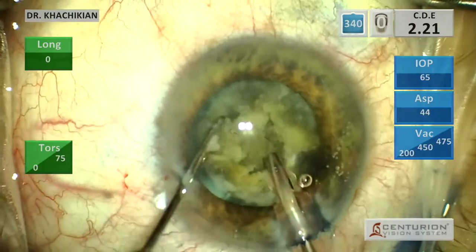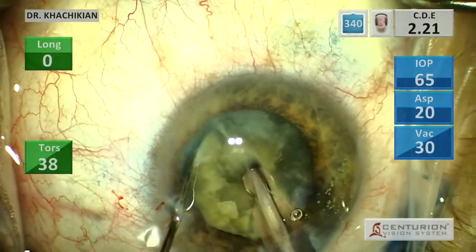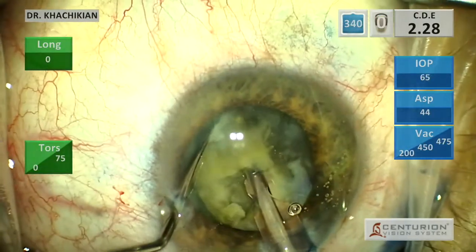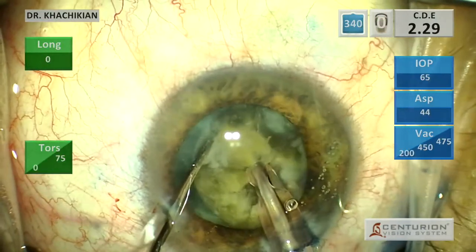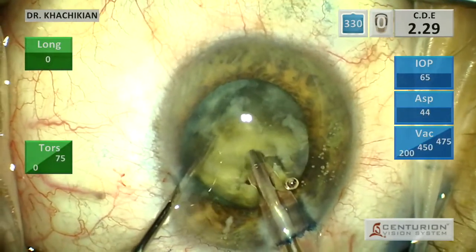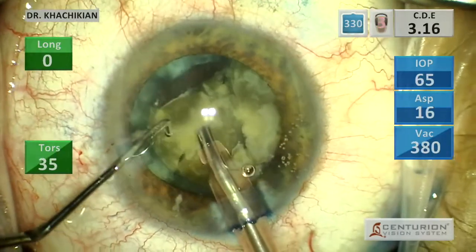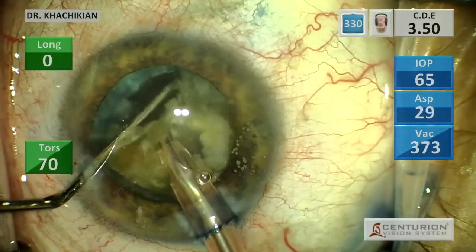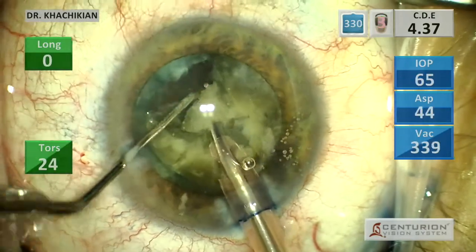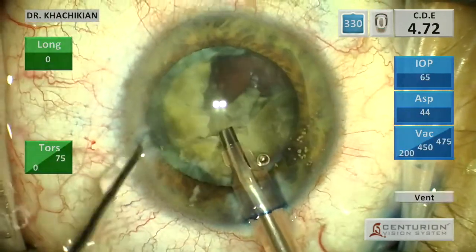There's another one with a lot of stretching — you can see that lateral stretching of the lens. Lateral movements are very well tolerated inside the eye. When you're stretching laterally, because the zonular support is lateral, you're pushing into support, which is more forgiving when a piece is coming out. None of the chops propagated 100% through the anterior or posterior portions of the lens. But as you carousel the lens doing the chops, by the time you make it 360 degrees around, a piece will free up. And if it doesn't, you just keep going around until something does. You can see there's no cortical material — straight through to the posterior capsule — so then you want to be careful and refill with viscoelastic.